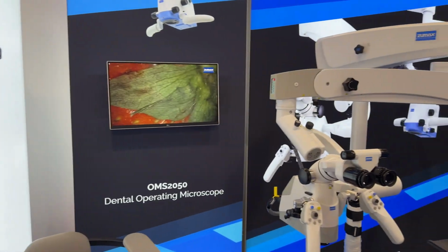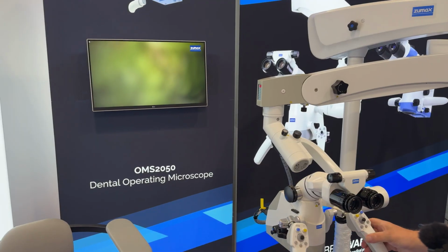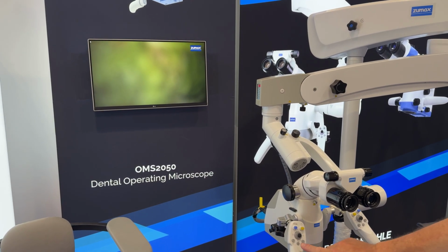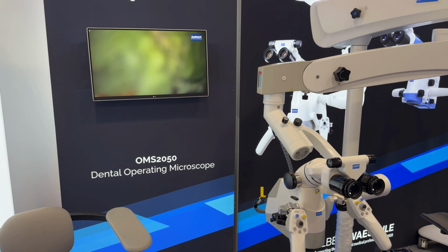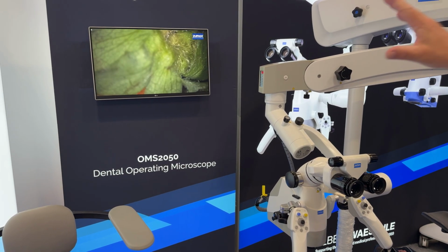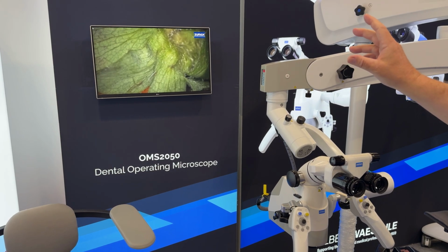Let's take another video of that. I wanna see that. That's brilliant. Right, so I'm out of focus here. So this button that's in the centre, you just hit that, and it will automatically focus on whichever object is at the centre of the screen.